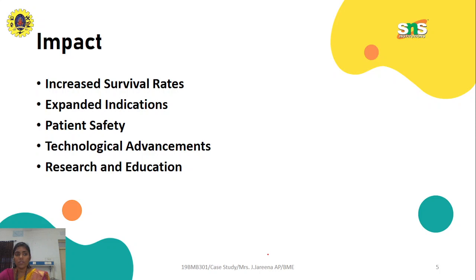Initially we started with increased survival rates. As I said before, the mortality rate of cardiac bypass surgery is very high when operating on a live functioning, blood-filled heart.